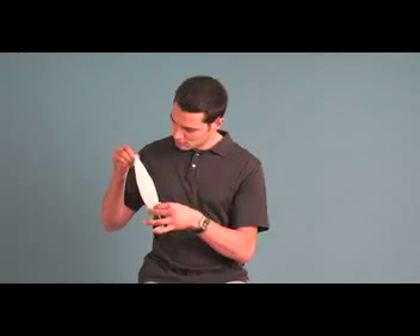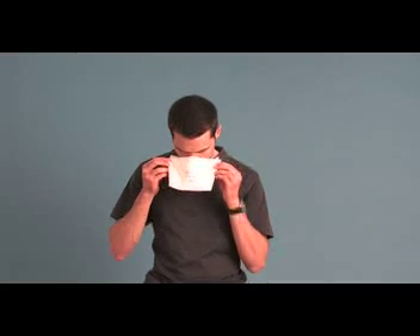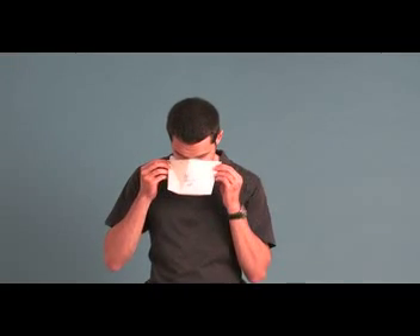Remove the top release liner by pulling at the tab so that the adhesive is exposed. Using the top center alignment fold as a guide, place the respirator over the bridge of your nose, below your eye sockets.